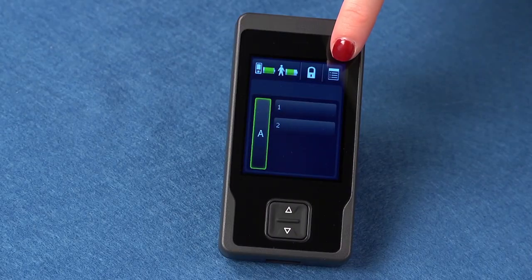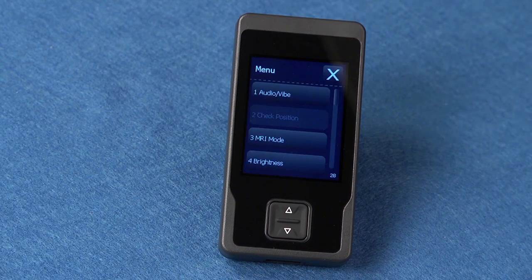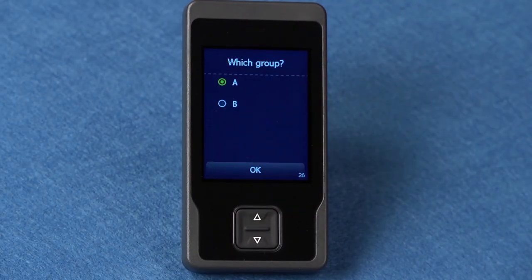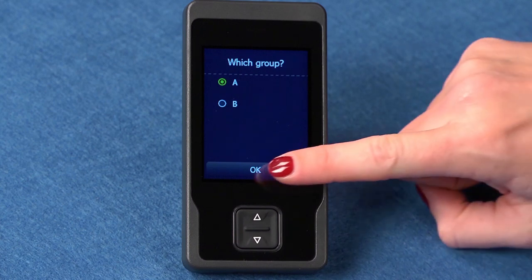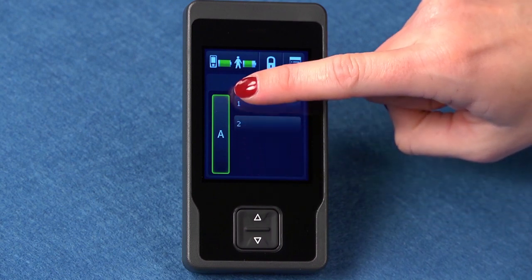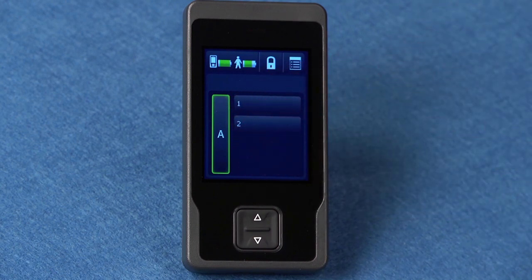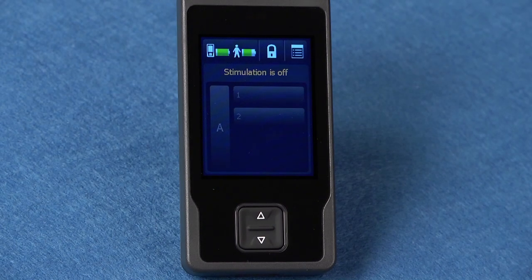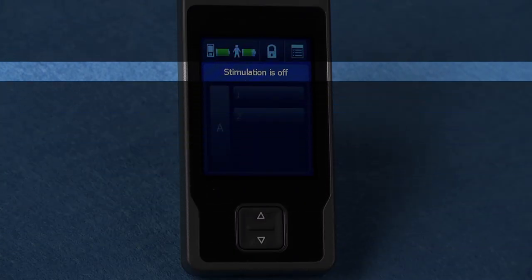The menu button is on the top right of the screen. Press this button to access the menu screen. The group button is found here. Press to show the group name, indicated by A, B, or C. Green highlighting indicates the group is active. The group button will be gray when stimulation is off.